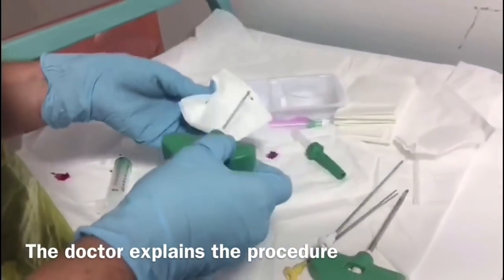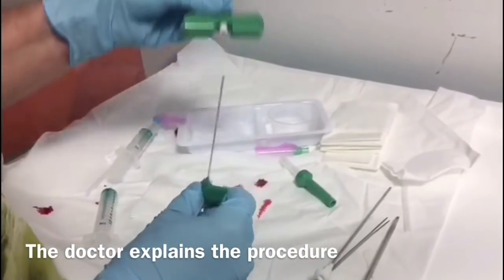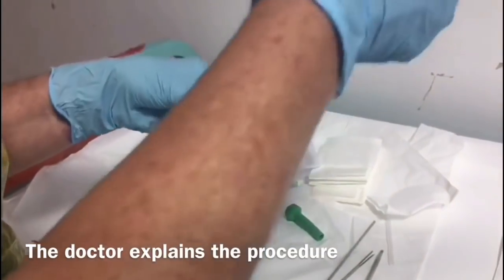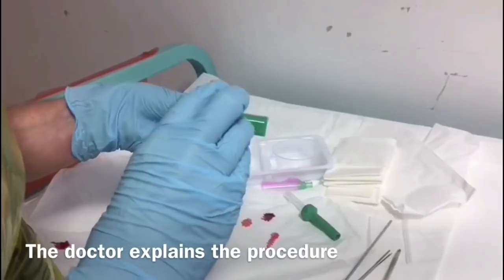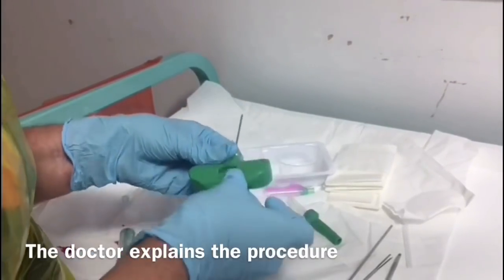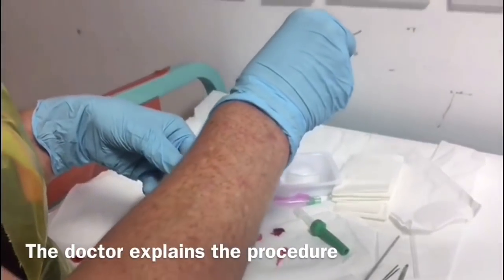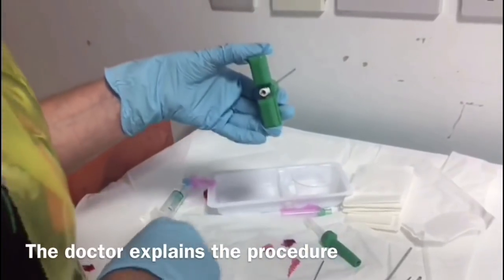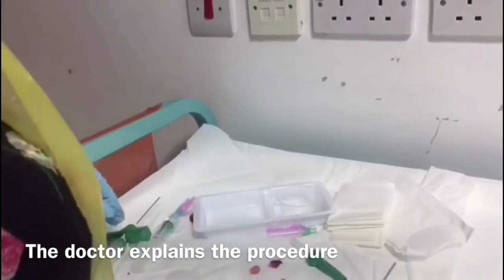So this is the aspirate needle. What this is is a hollow needle with a bit in the middle. If you just had a hollow needle and you went into the bone, the bone would go up the inside of the hollow needle. That's why when you put it into the bone initially, it has the stylet on the end. So you go into the outside, through the bone into the marrow, you take that bit out, and then you attach the syringe and you suck it out. And then that one's finished.